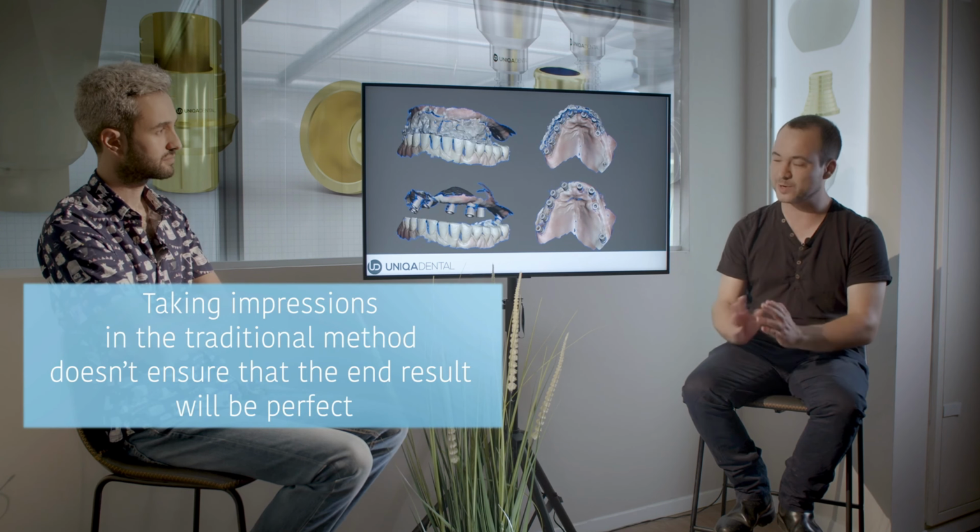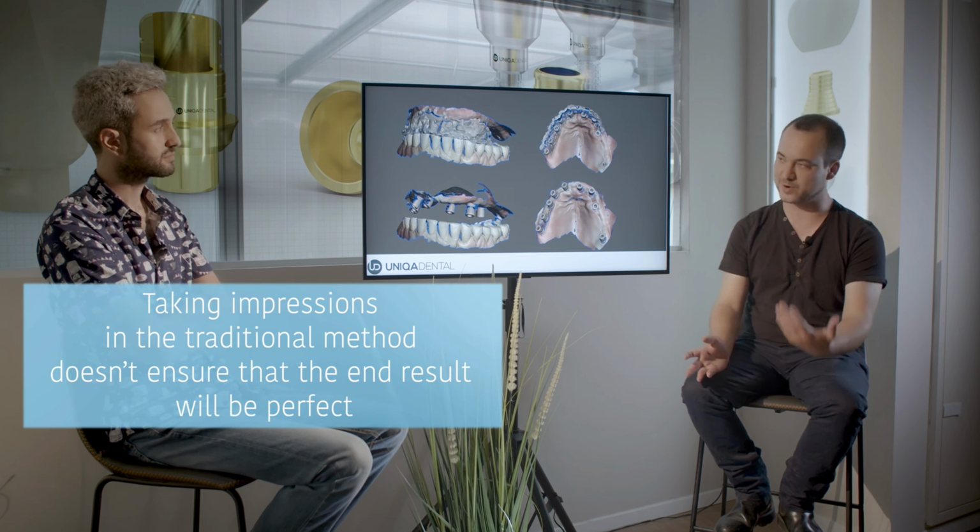If it deformed or didn't sit till the end, you don't know what you'll get. And the next time when you check it, you already have crowns. You can't be sure that the end crowns will be similar to the relations you got. In here, everything is in your hands. You can see it right away, and you know if what you got is the same as what's in the mouth.